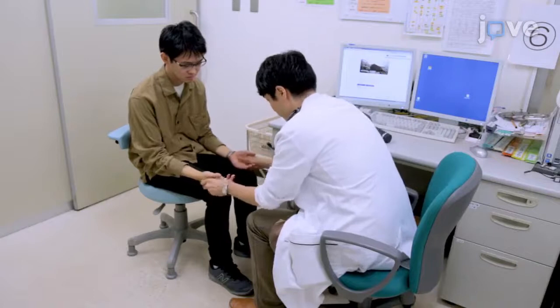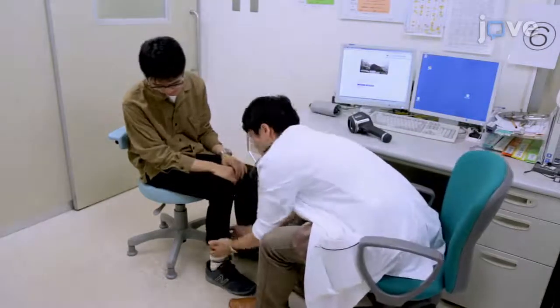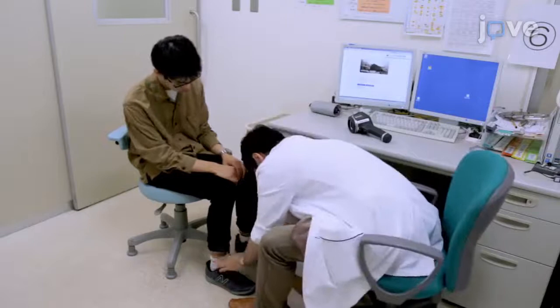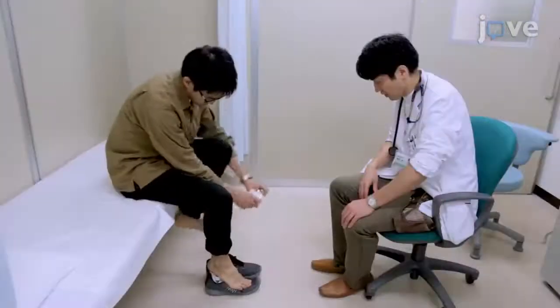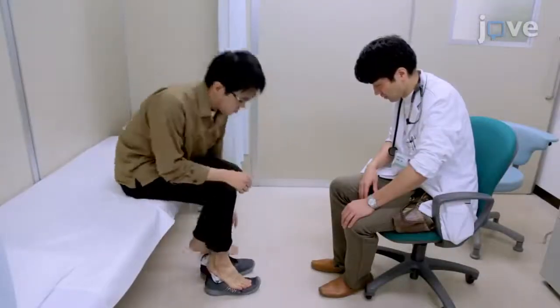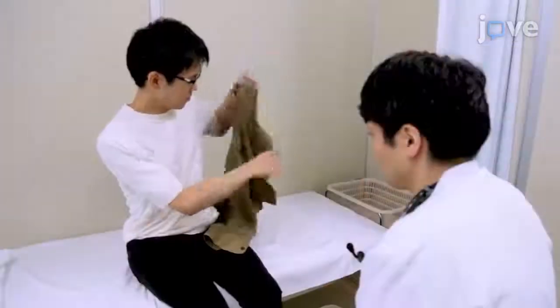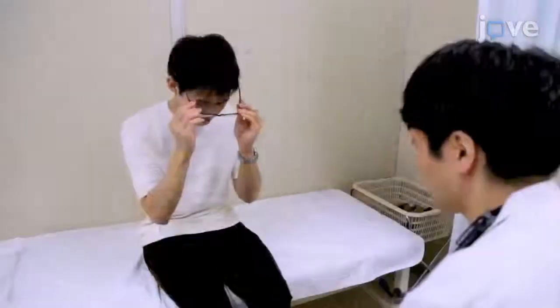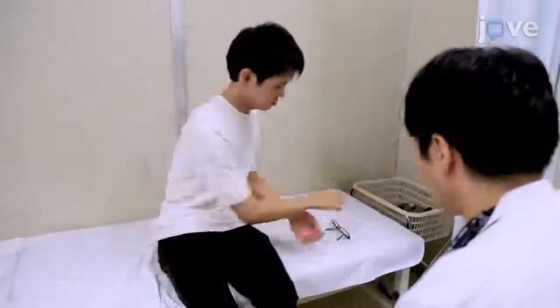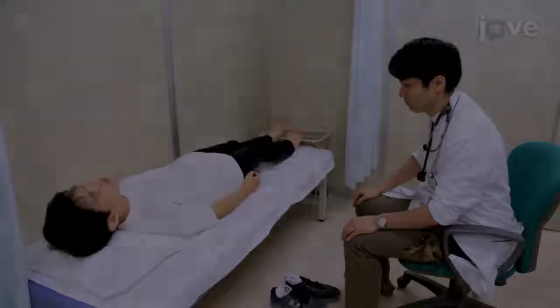To subjectively determine the laterality of the body surface temperature, first palpate patients with suspected Wallenberg's syndrome. To acquire thermographic images, instruct the patient to remove their socks and shoes and have the patient remove enough clothing to enable examination of the abdominal region as per their consent. As soon as Wallenberg's syndrome is suspected, have the patient proceed with the examination.